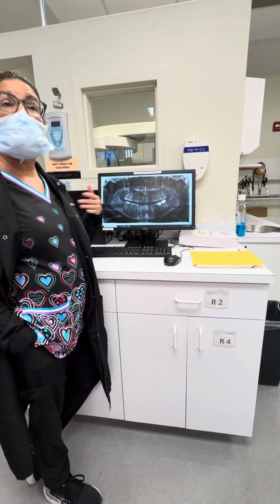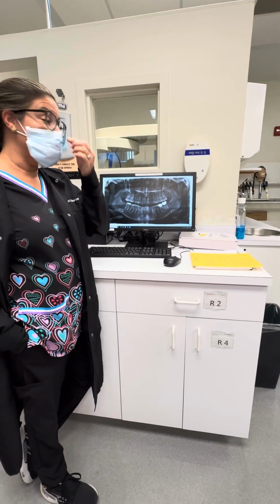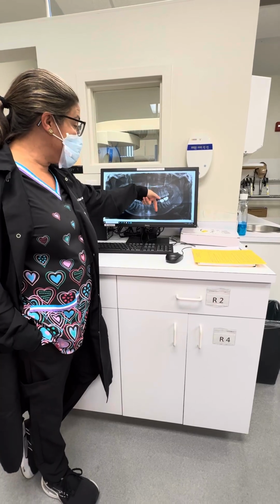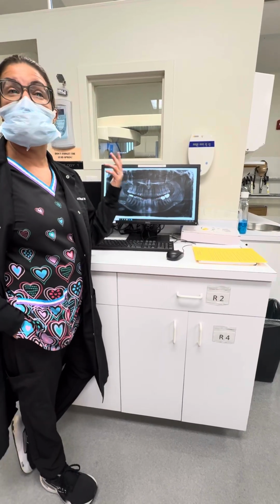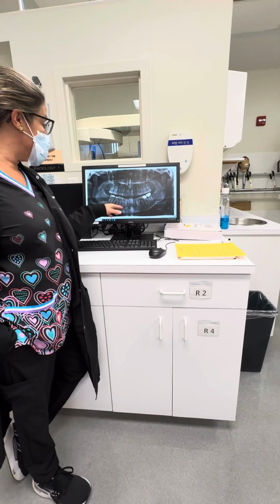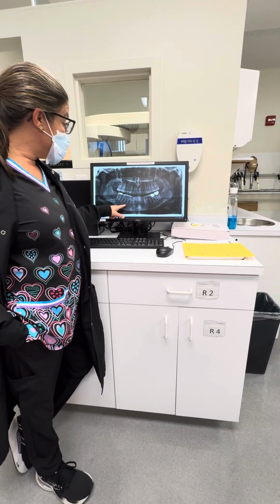So if you had seen this radiograph and you were going to be doing anesthesia on me, you would know that instead of doing the normal injection where we basically take the cartridge down here between the two teeth, it would be better to do it closer to that second premolar if you know that that's where the mental foramen is. Does anybody remember what the name of the nerve is that comes out of the mental foramen?